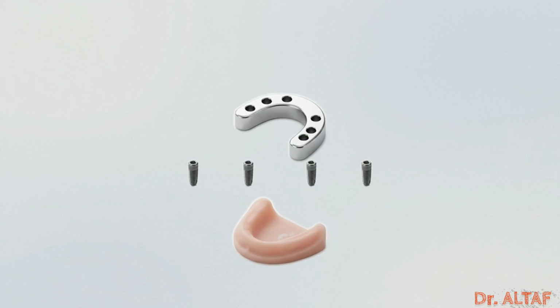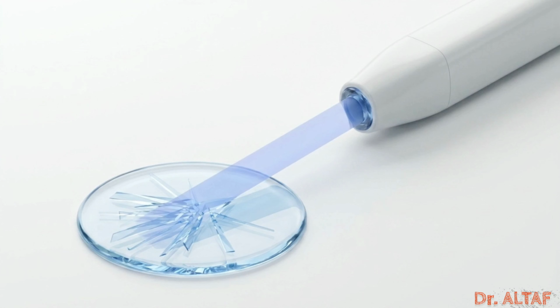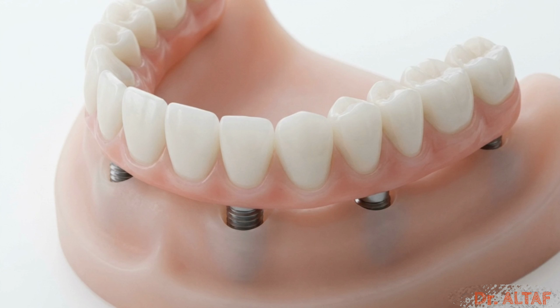Adopting photogrammetry for full arches is not an elective luxury or a matter of clinical preference. It is a mechanical necessity born directly from the limits of light and software. Understanding the exact mathematical boundaries of our clinical tools is the only reliable way to consistently achieve the uncompromising, tension-free standard required in modern digital implantology.